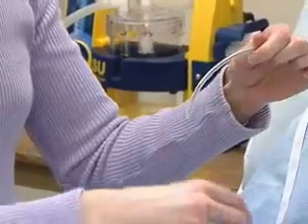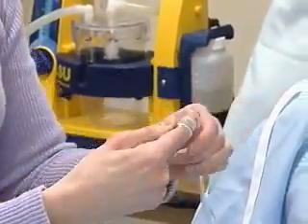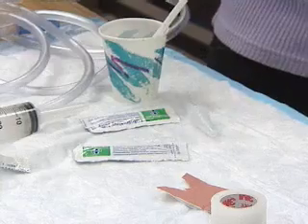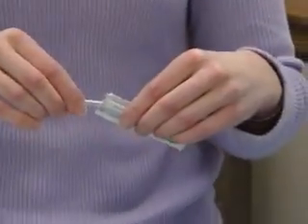We can create a gentle curve in the pliable tubing by winding 4 to 6 inches of tube tightly around the index finger. Then lubricate the end of the tube to be inserted. 3 or 4 inches should do.